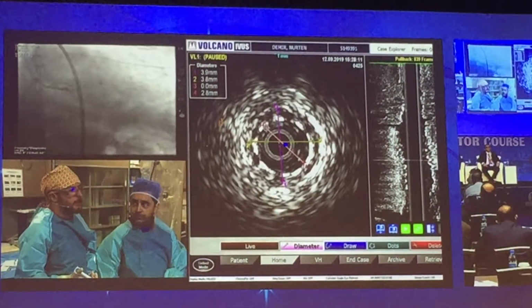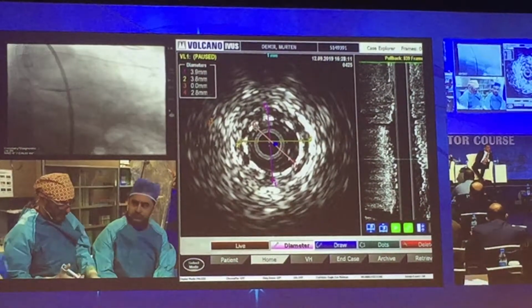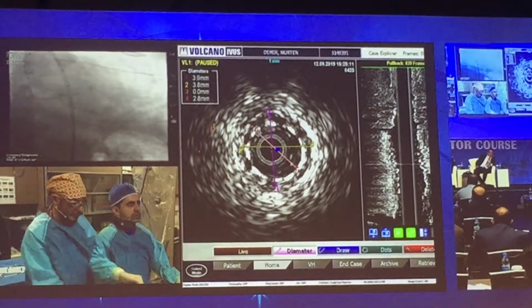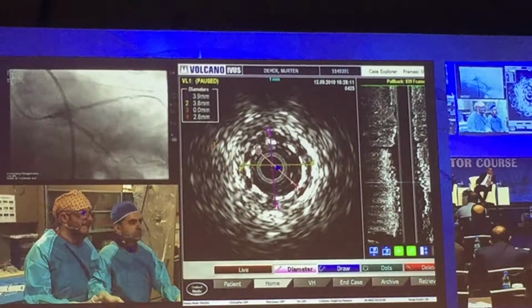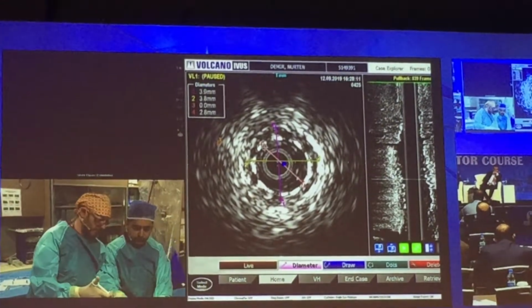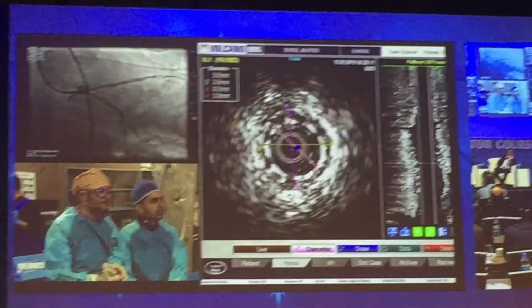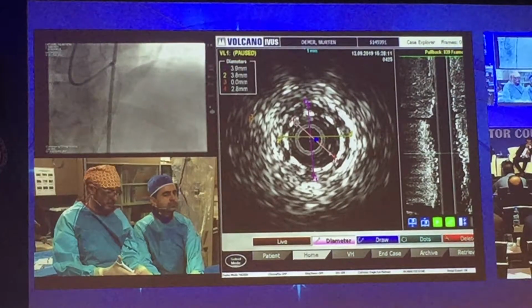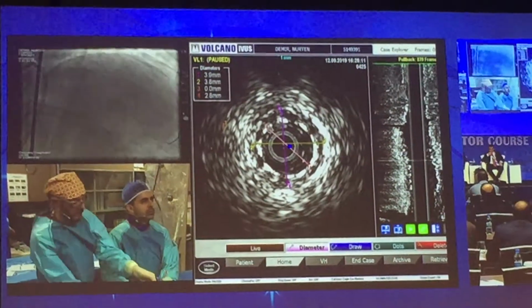What do you think about drug-eluting ballooning in the distal part? Okay. What about IVUS in the distal segment? Check it out. We always see after the CTO procedures, the distal part of the CTO looks like this due to low flow. We should check the IVUS and maybe take time to wait for healing of the segment. The panel is advising an IVUS for the segment distal from the diagonal bifurcation. Okay. Yes. Okay, we will do that. Ready? Do you give any nitro at this point?